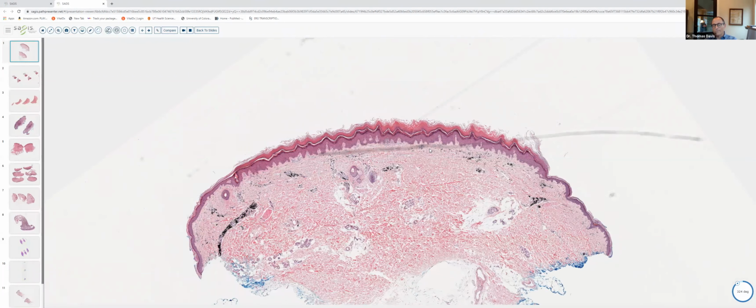one can see these kind of irregularly shaped blue, purple, almost arabesque net-like structures. And they are surrounded at the periphery by granulomatous inflammation. And this is gel foam, and a very characteristic appearance gel foam does. It almost looks a little like a pterodactyl or like jellyfish, like some type of alien structure here. Very distinctive appearance.